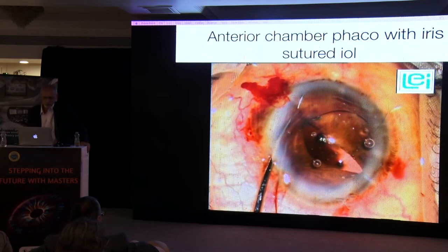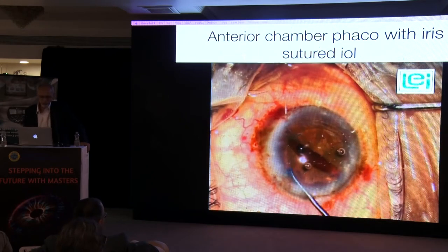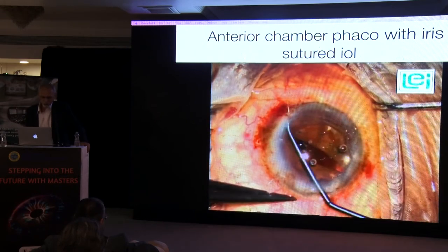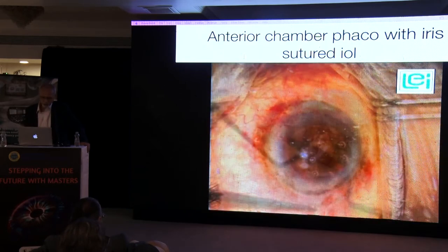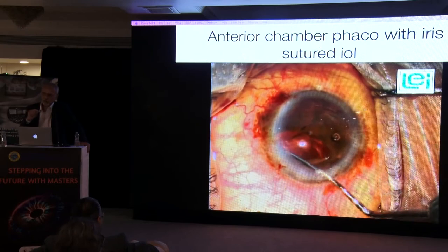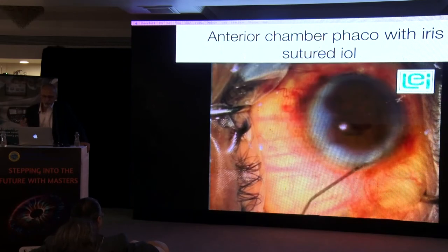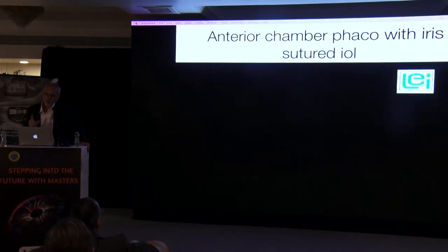This was the time when we didn't have this single pass, four throw, but we had Sipser technique of suturing. So the Lester hook, you could bring those sutures out through the main opening. But today we would do it differently. We'll make side ports and take it out. And once those sutures are tied, the optic is pushed back behind the iris, and that's it. And these patients do extremely well. There's no pseudophacodonesis. The lens stays there pretty well, and they do quite good.